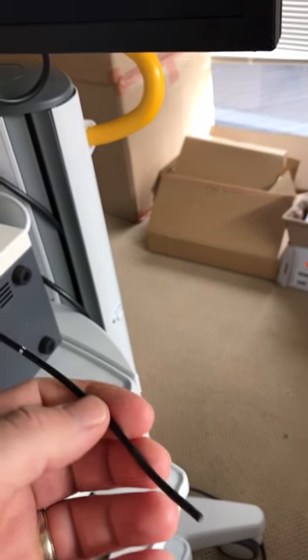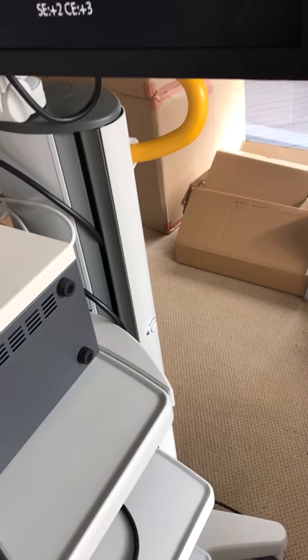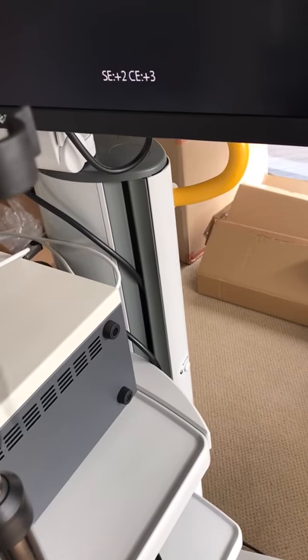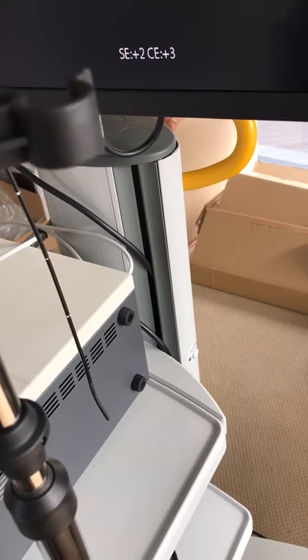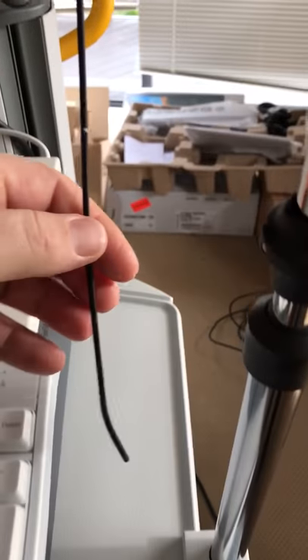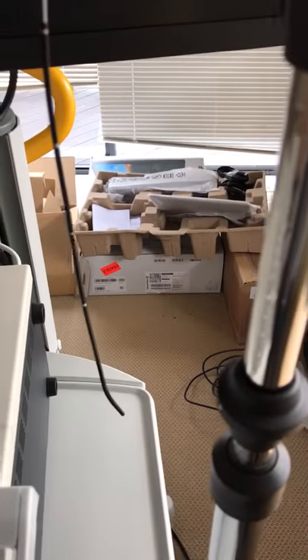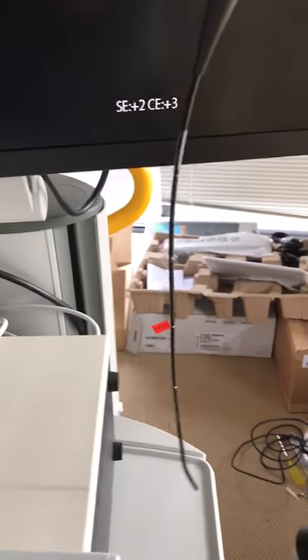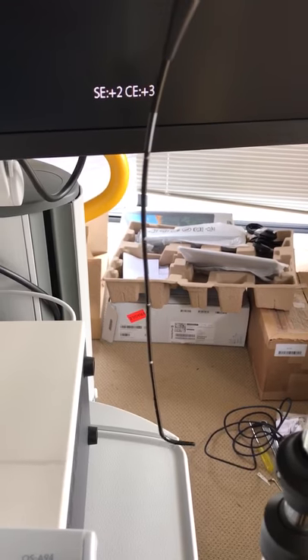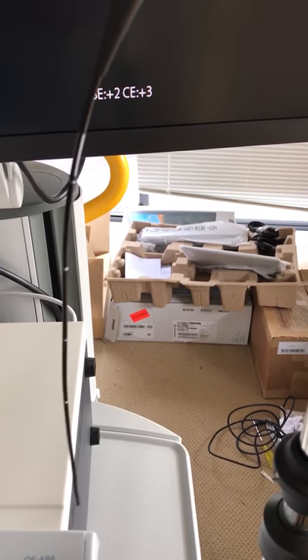This scope is reputedly the smallest pediatric videoscope currently on the market. It boasts a 2.4 millimeter outer diameter, working its way up at its thickest point to 2.9 mm outer diameter.